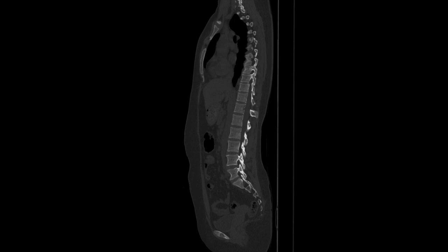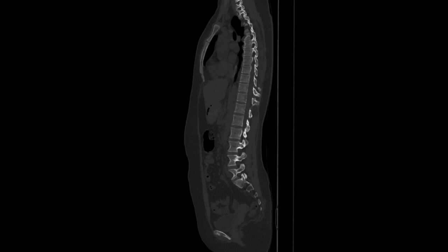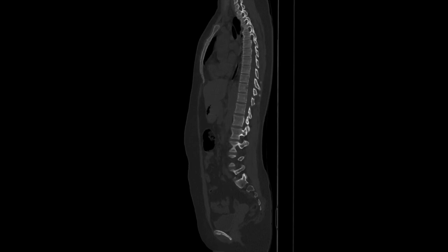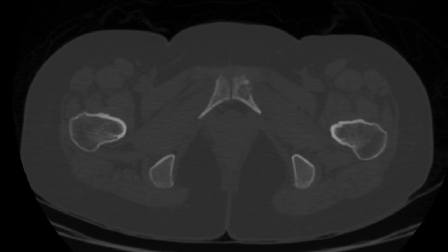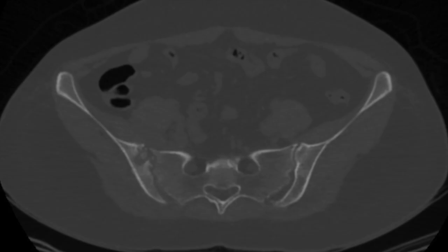In view of the lesion involving the right third rib, CT screening of the chest and abdomen was performed. CT showed an expansile lytic lesion involving the rib. A permeative lytic lesion was seen in the spinous process of D11 vertebra. Lytic lesions showing a radiolucent rim and central dense sclerotic bone were seen in the left pubic bone and right iliac bone, consistent with button sequestrum. Erosions and irregularity were seen along the articular aspects of the right sacroiliac joint, consistent with sacroiliitis.